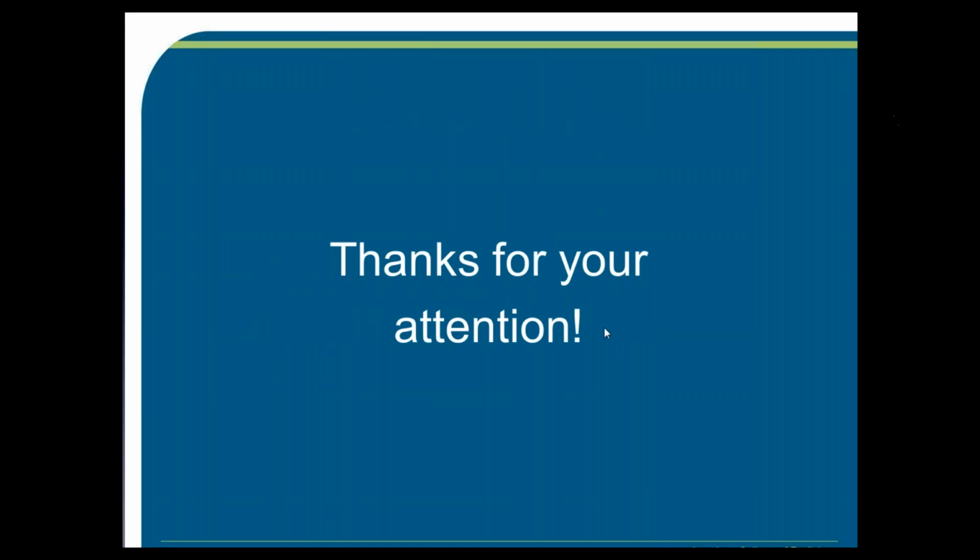Thank you very much, Franklin. That was an excellent presentation. It really helped to clarify some of the practical points of view of how to get ACR TI-RADS into your practice. We're now going to hand the controls over to Dr. Bill Middleton, who is going to do the next section on imaging examples using ACR TI-RADS.